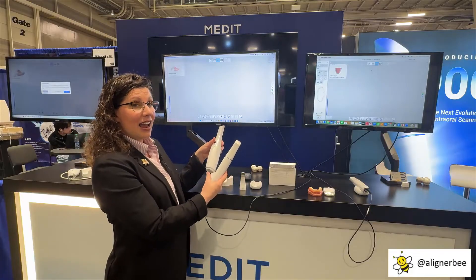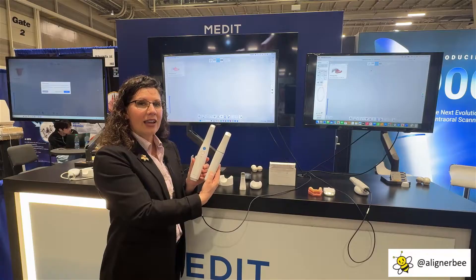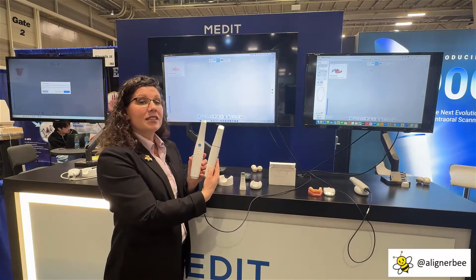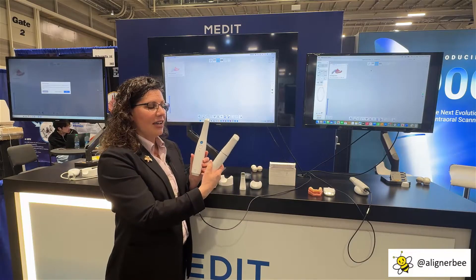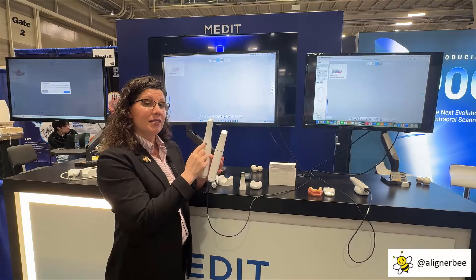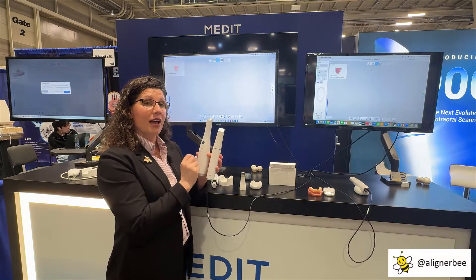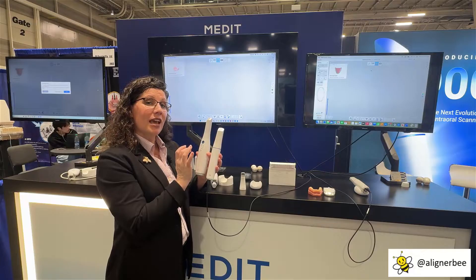Last week, the Medit i900 was released, and we can see here when we compare it in size to the i700, the significant change in size and ease of grip for the operator. They've also transitioned from buttons that turn the scanner on and off to a double-touch band to turn the scanner on and off.